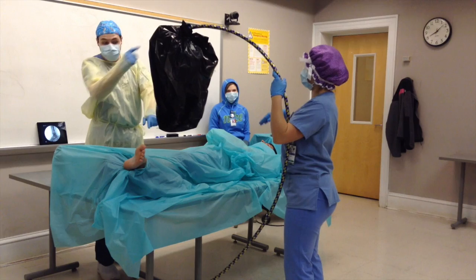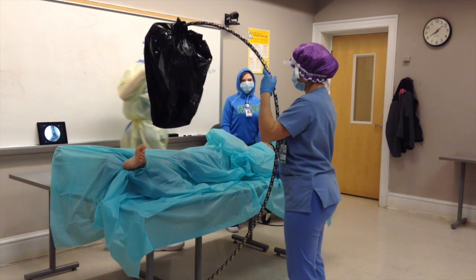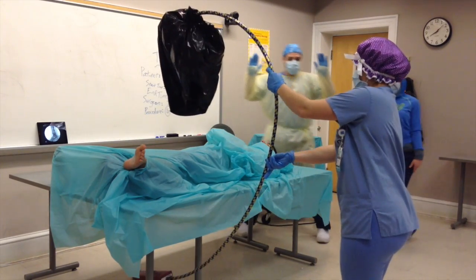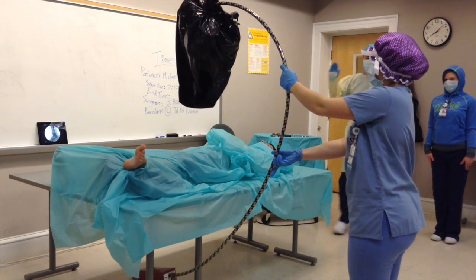Workers in the immediate area should also stand as far away as possible from the X-ray tube, as the most effective method of radiation protection is distance. A general rule is that radiation exposure decreases by the factor one over distance squared.